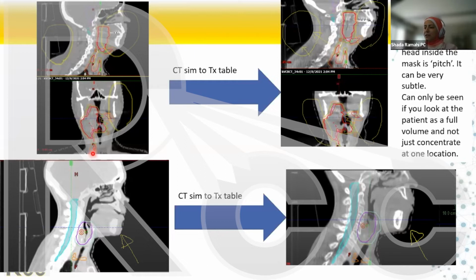And also look at here, this is the same patient. If you look at the coronal cut, you see that its mask is nicely conformed to the lateral sides of the patient. Bainama here, because the patient is not well aligned within the mask, it's very loose. So now what do you do? The question is, what do we do?